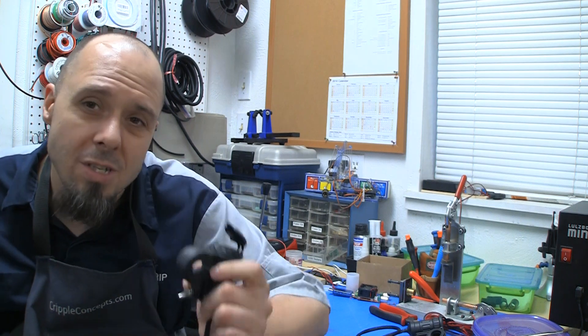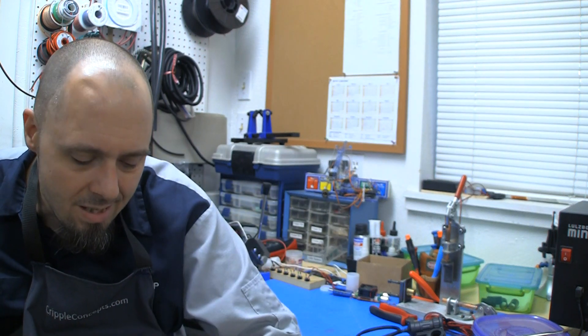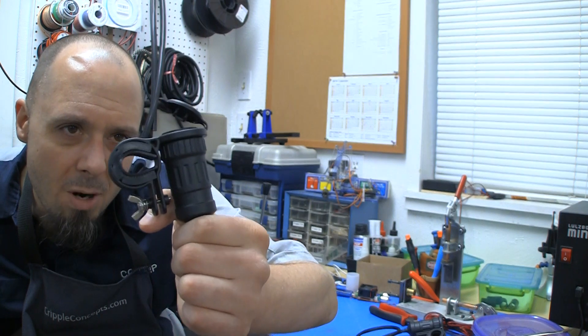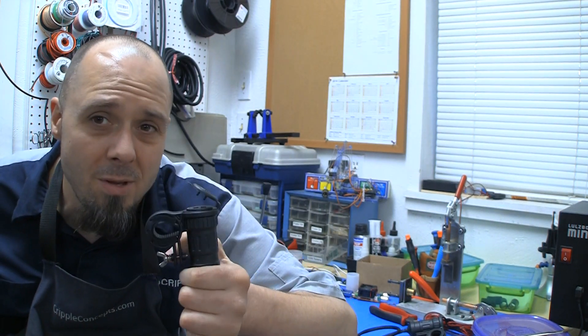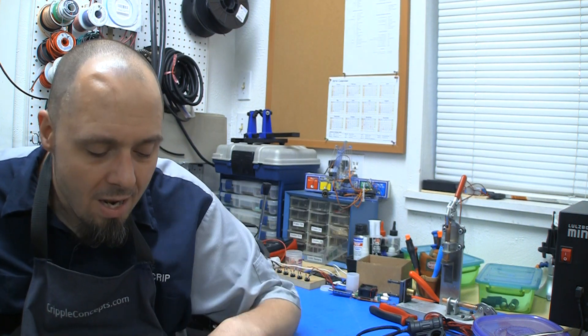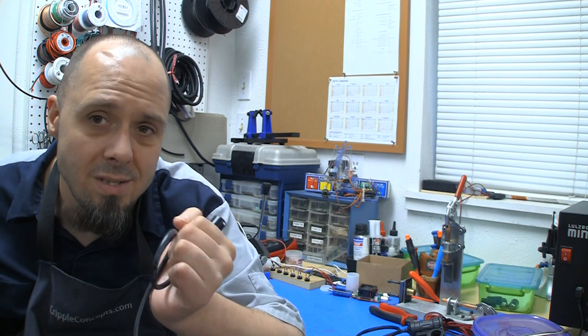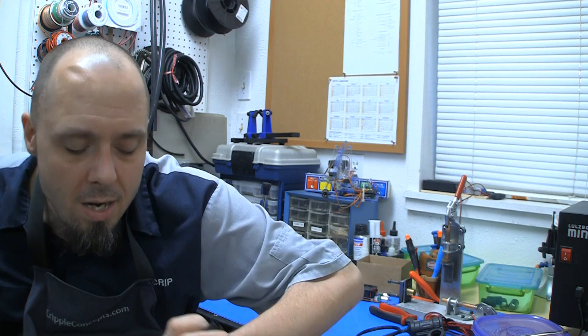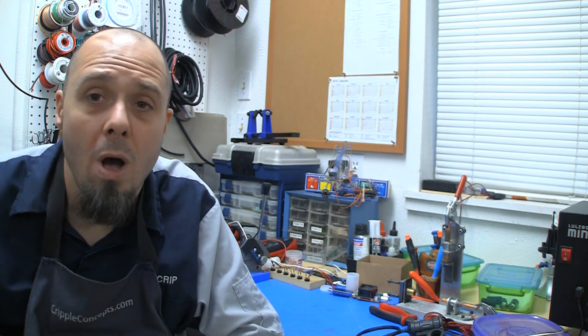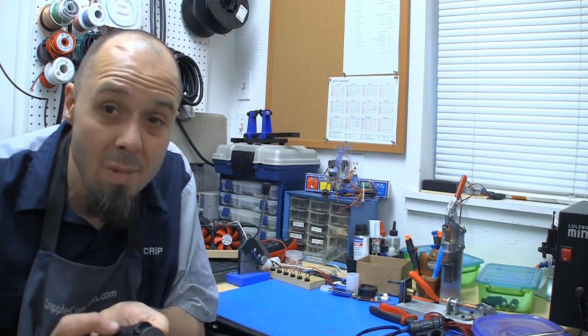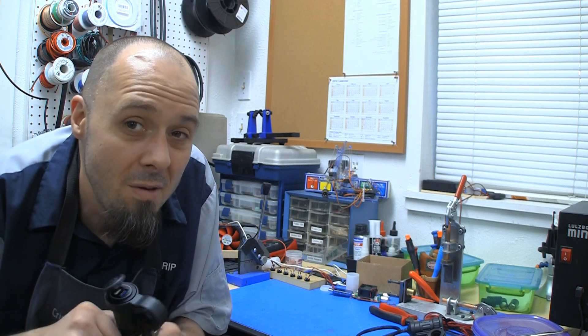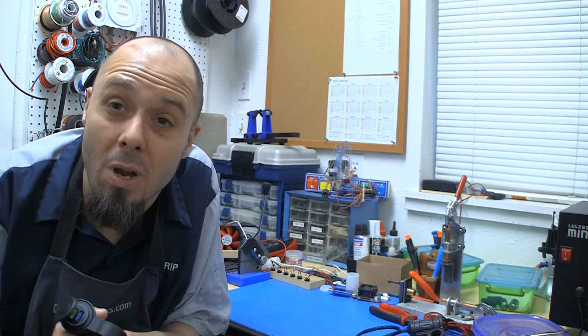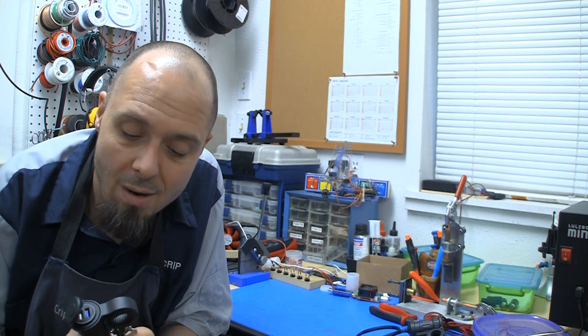The housing's a little bit large, it's a couple inches of diameter probably, it would stick out a little bit, but if you had a good convenient spot to mount this on your chair, I could probably mount it on my armrest or something. Now you still have to have the plug, you still have to plug this in and out every day, because it plugs in the same port that you charge the chair in, so you do still have that. But I mean, overall, well-made, if they're getting these custom-made, they've got some money in the injection molding and stuff.